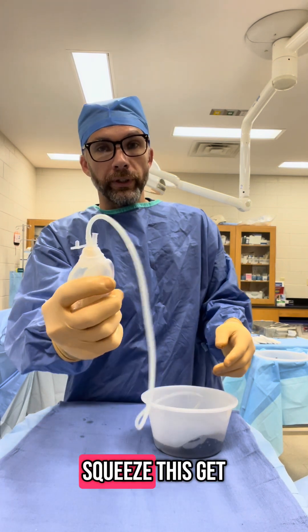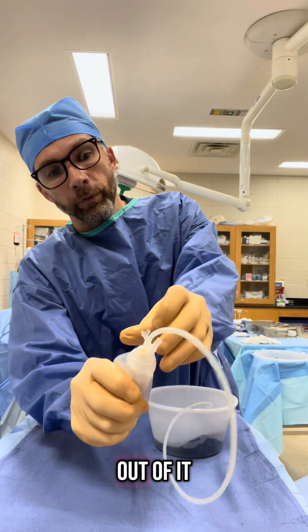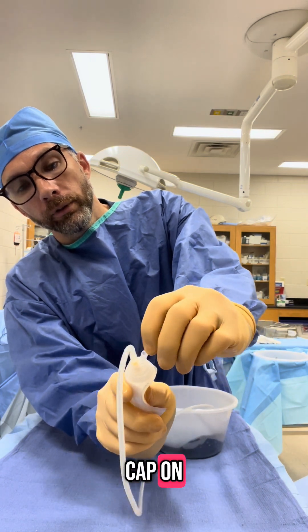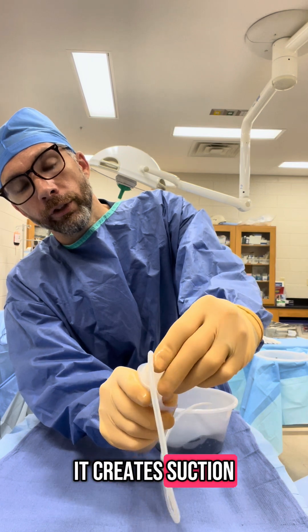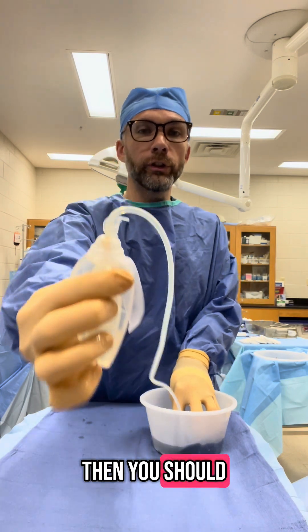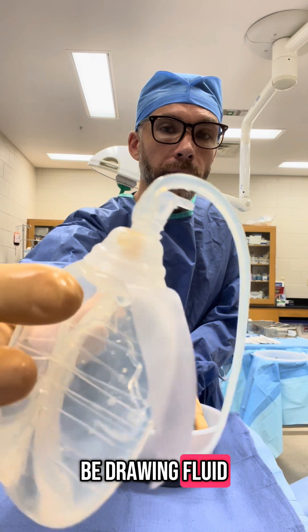So if you squeeze this, get all the air out of it that you can, and put the cap on, it creates suction down on the other end where the little holes are. So then you should be drawing fluid out.